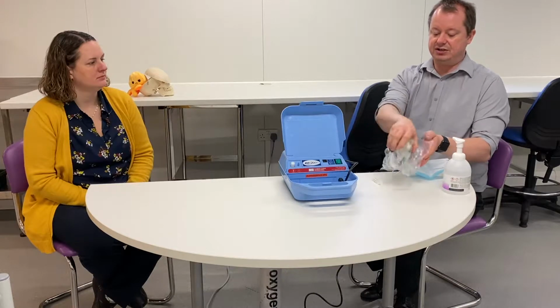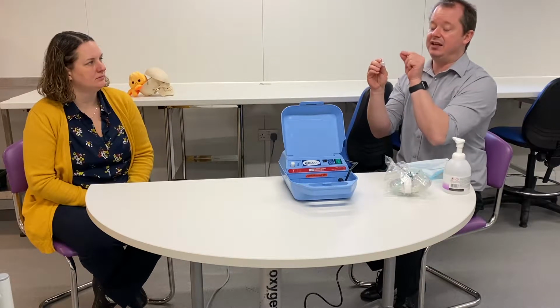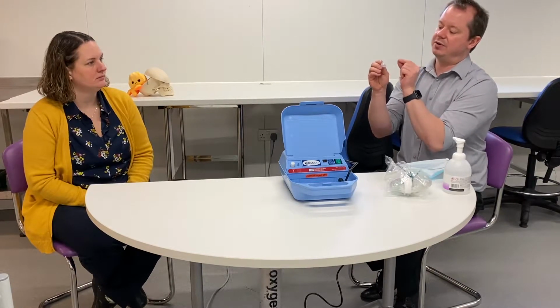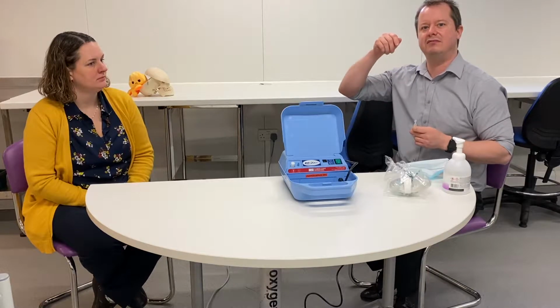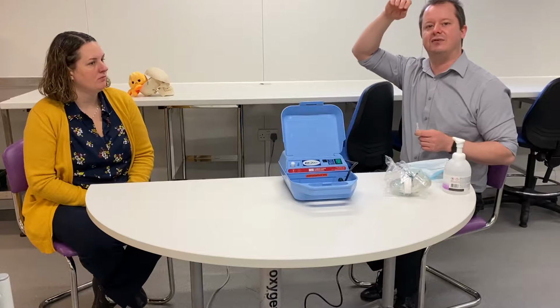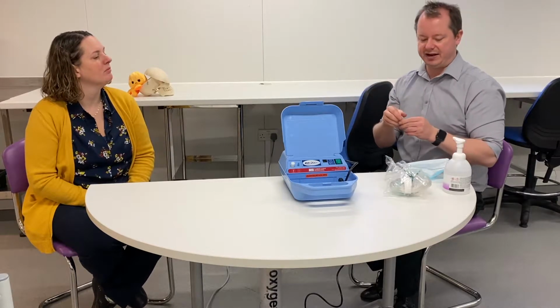And then we also need to collect our drug, which for this one we're going to use is a saline nebulizer. So what you need to do is check the name of the drug, saline, and the dosage strength, so 0.9% saline, and it's 2.5 mils. We need to make sure that it's for inhaled medication, so that's an important step, because saline can come for IV use or subcut use, and this is specifically for inhaled use. And then it has an expiry date on the back.